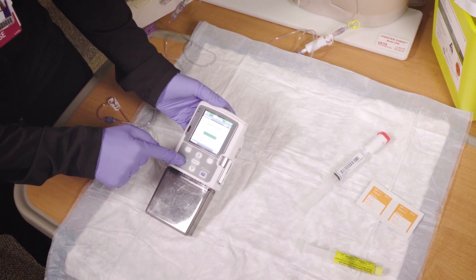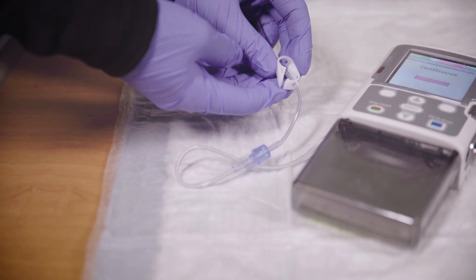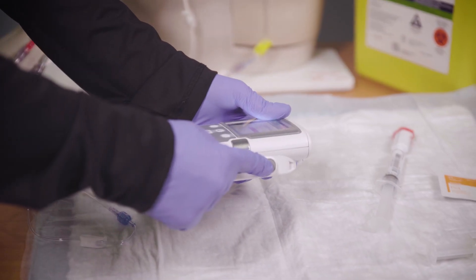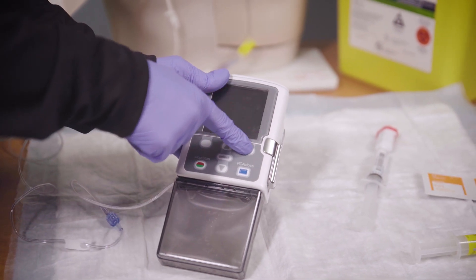Press stop/start on the pump, then press yes to confirm you want to stop the pump. Close the clamps on both the pump tubing and your central line tubing. Turn the pump off by pressing the on/off button on the side of the pump and press yes to shut off the pump.